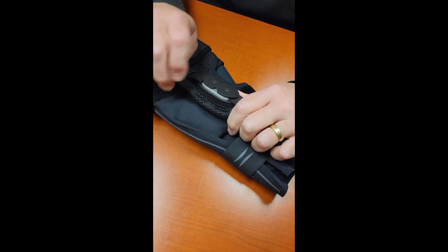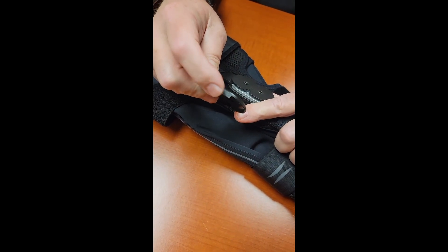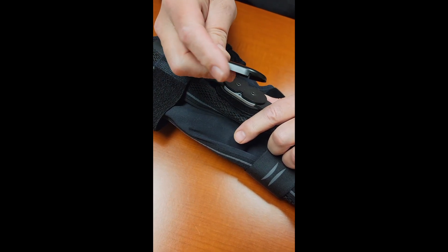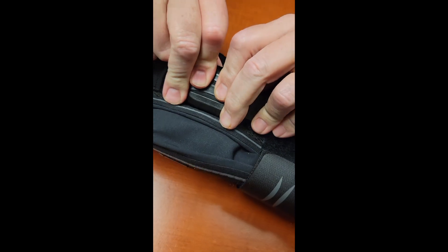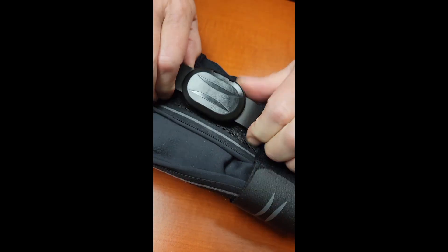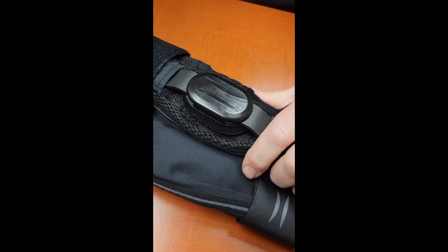Now that it's in place it's completely locked out. To ensure that long term, take the cap — normally the slide guard is on the extension side of the brace — flip it around and put the slide guard on the flexion side of the brace, click it in place, and now that is locked in position for full flexion lock.